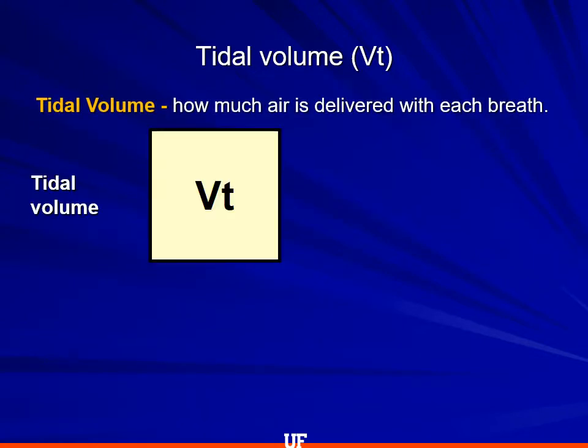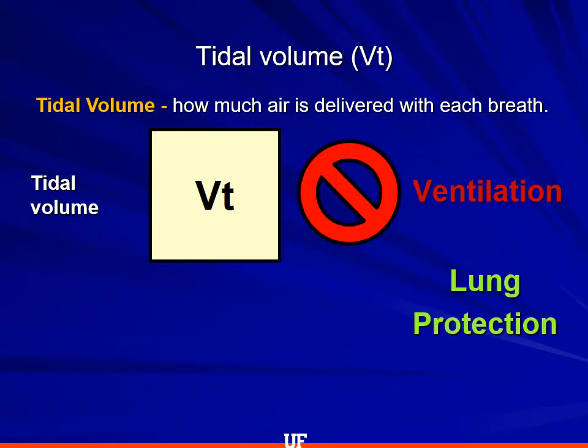What you should know about tidal volume is that this number is just set to protect their lungs, to prevent ARDS. It's based on their ideal body weight, which is based on their height, and so the number that we set in the field should stay the same in the ER, should be the same in the ICU, and even if they go to a rehab hospital weeks later on a ventilator, their tidal volume should still be the same. Do we use tidal volume to address minute-to-minute ventilation? No. We just use tidal volume for lung protection.